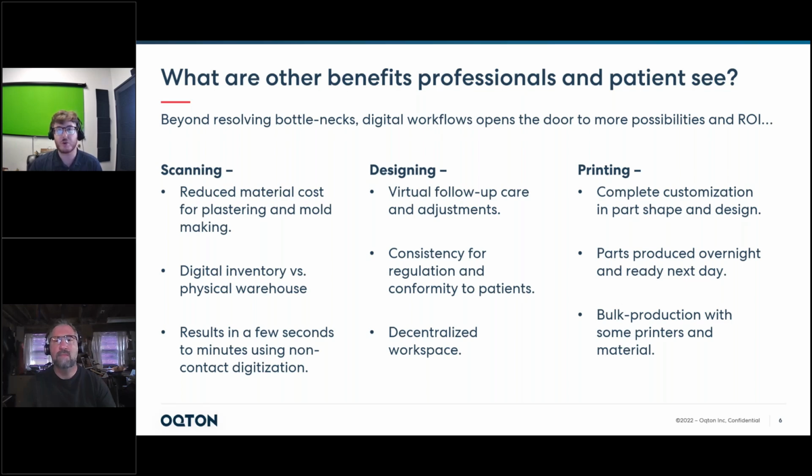And the decentralized workspace is something that is very important. Being able to just work on the fly, create your parts wherever you are, and work with your different digital data is very paramount for the quicker lead times that can lead to better patient experiences.